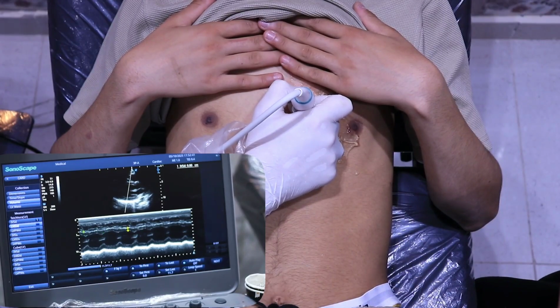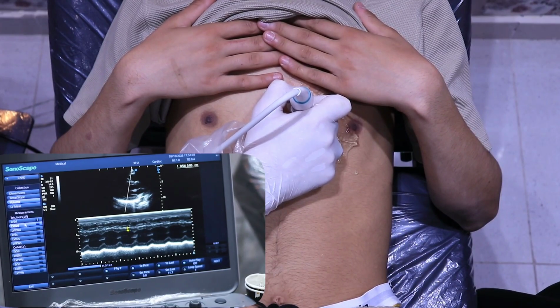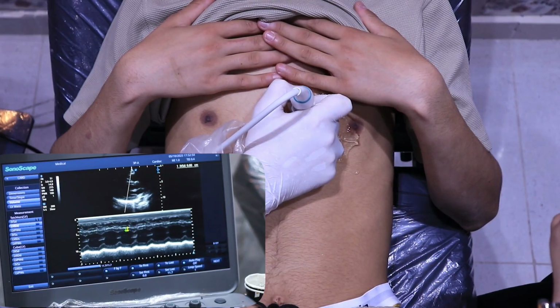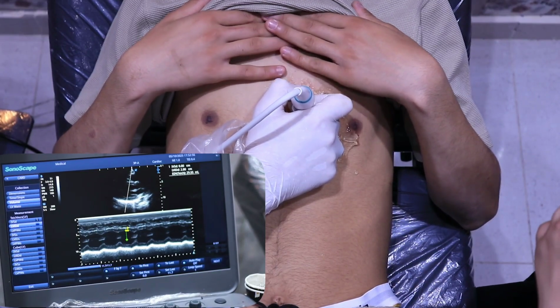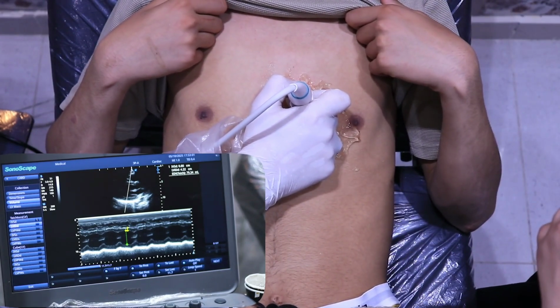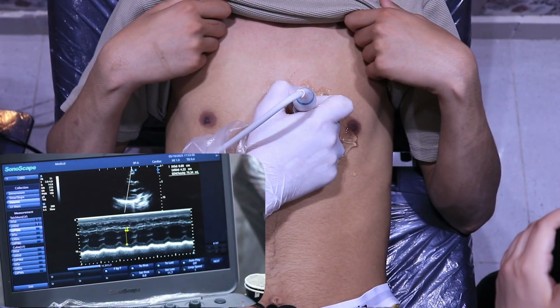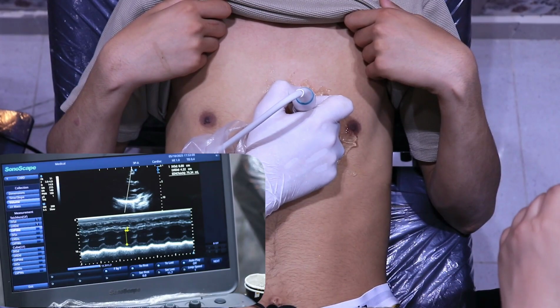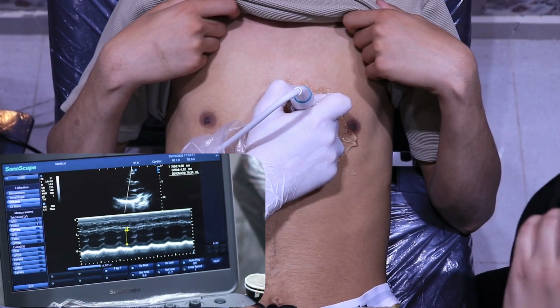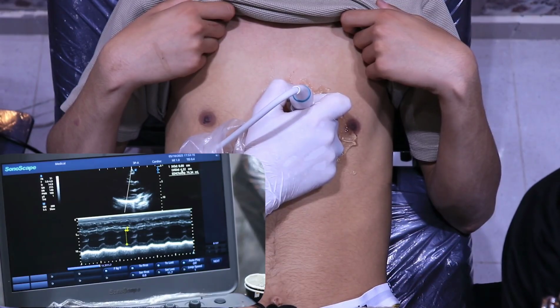تعال بقى نشوف ال internal diameter during diastole. Okay? So we'll take this one. Select. And we go from here till here, okay? So this is the leading edge, right? خلاص I select here, مش كده؟ يبقى this is the internal diameter, 4.2 سنتي. شايفين يا جماعة measurements? This is 4.2 centimeter, which is 42 millimeter, right?